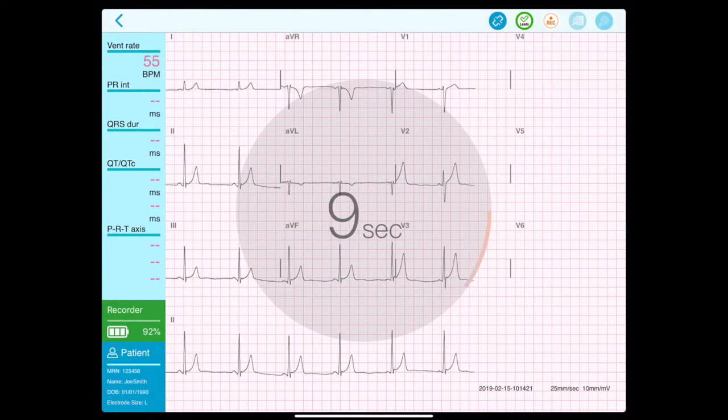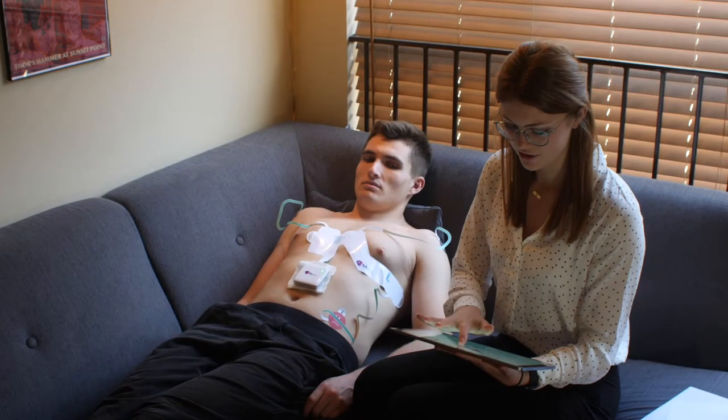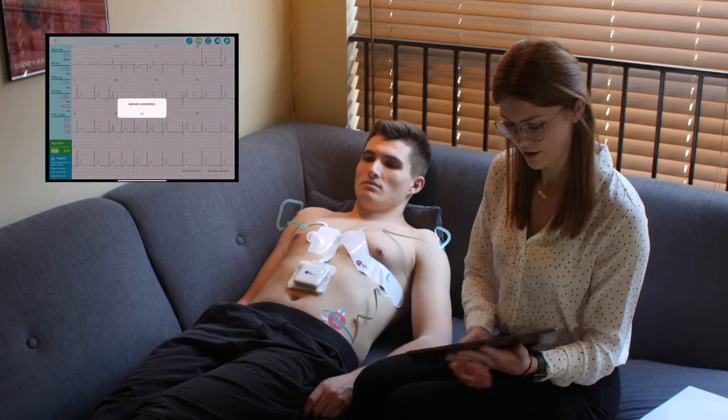Tap the record button and a 10-second countdown will appear while the ECG is being recorded. Remain still during the recording. Movement may disrupt your ECG reading. The signals will be processed immediately then uploaded to the cloud.